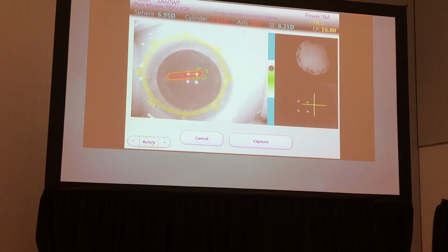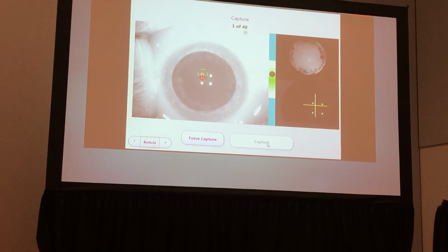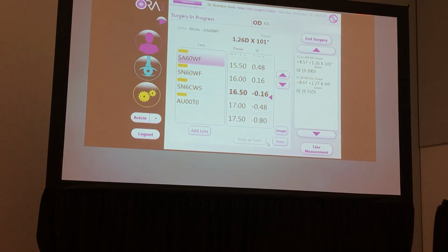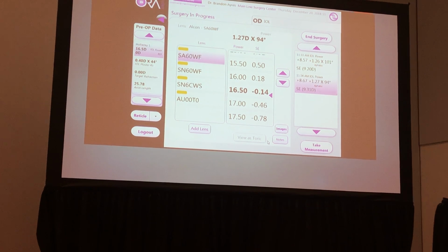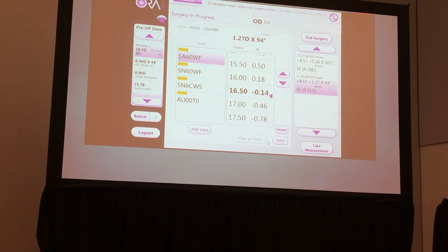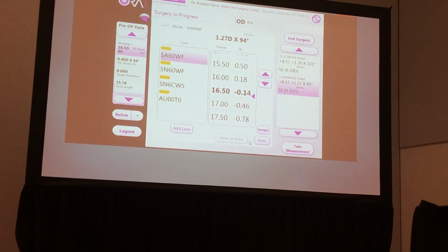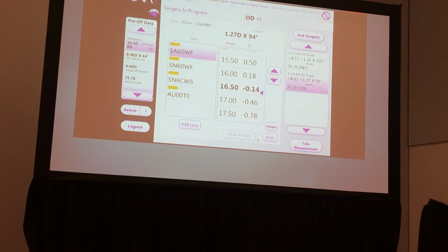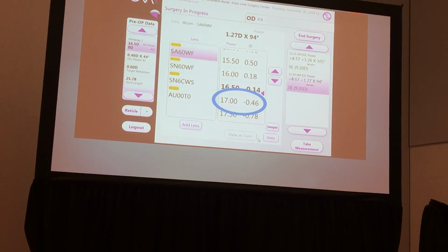Yes. So you've got to align the X in the lower right, look at the fringe pattern, upper right, right there, and then you get it centered in the big screen. So very similar. So we have, in the room, 16.5, 17, and 16. Right? So these are all ways to refine your sphere. She's a little myopic now, and she kind of likes it, so I can actually go to the 17, leave about -1/2.